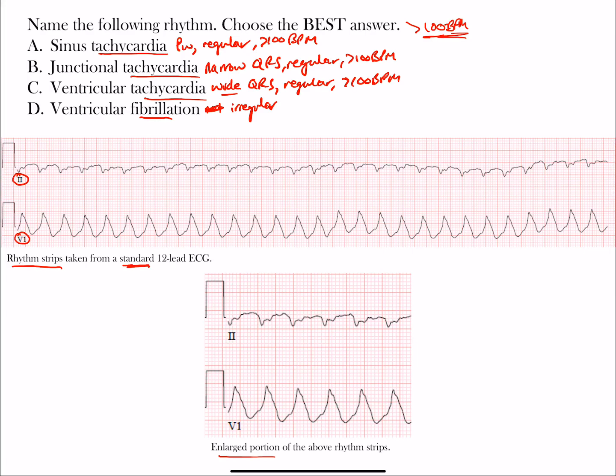If we look at the rhythm strip, take a look at V1. You notice if we take those tall peaks of the waves - this R wave to this R wave, that's our R-to-R interval. These are positive complexes. Here's the next R-to-R interval. If you were to measure all of these out, you'd see that all these intervals are the same, meaning this is a regular rhythm. This is certainly not ventricular fibrillation, so D is not correct.